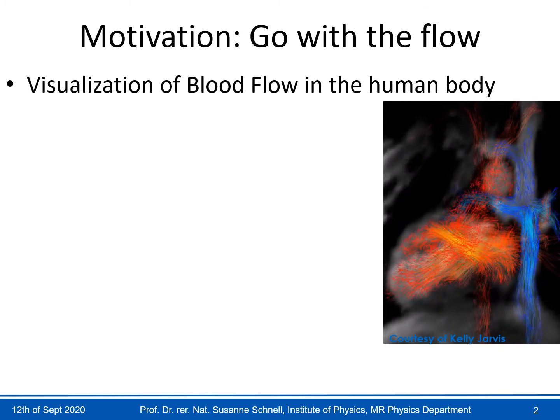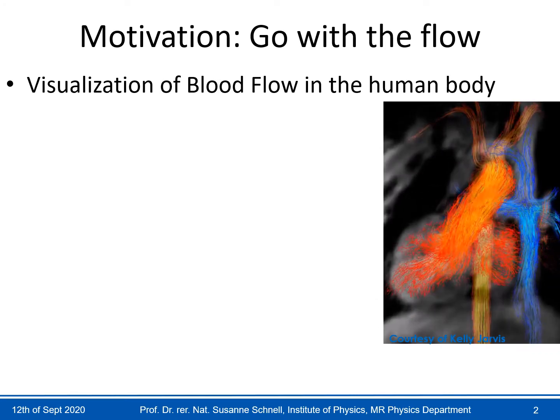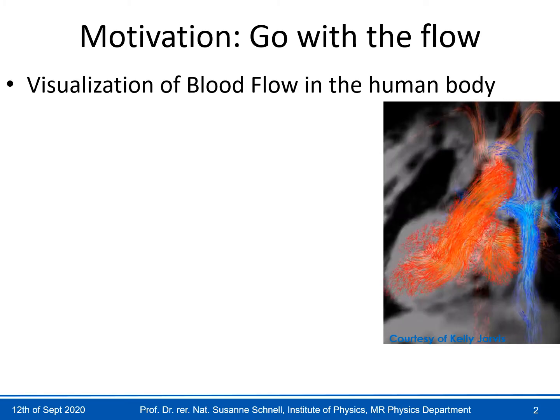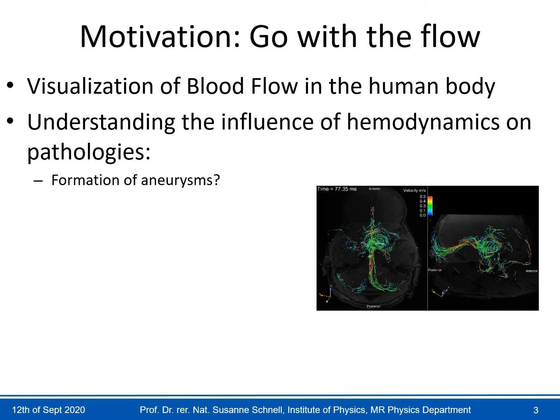Why are we interested in measuring the blood flow in the human body? Well, first of all, we would like to visualize the blood flow, ideally in 3D and time resolved. This would allow us to see certain issues in the vascular system visually and also assess this in a rather qualitative manner.